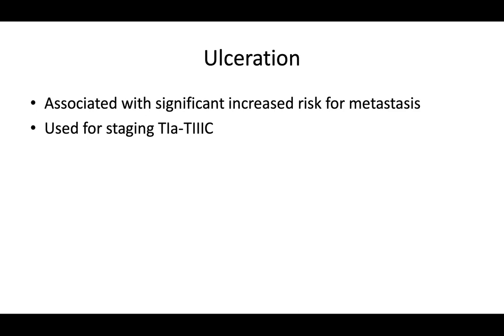So if I have subcorneal hemorrhage, but there's still a stratum corneum in there, I'm not going to really call it a straight up B designation for ulceration if I still have some stratum corneum. However, there have been cases where I've had a designation of ulceration given to a case, and that was because it looks like there's a lack of epidermis in an area, but the stratum corneum is still there, which is technically not ulceration.